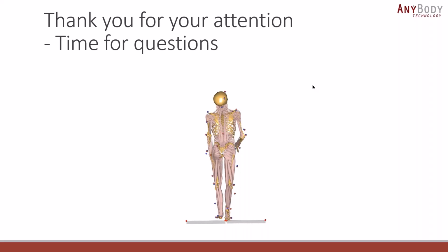Yeah, so the next question, Periklis, is about whether, after doing your study, you looked at the alignment, if you could find any categories or patient characteristics that would group the alignment that came out of your study. Yeah, very good question. And a tricky one, I would say. As I said, we had different patients, and we would like to capture the patient-specific characteristics. So we first placed the implant according to mechanical alignment, as I said. So all the patients had a straight leg. After optimization, we noticed, of course, that there were some trends in alignment.